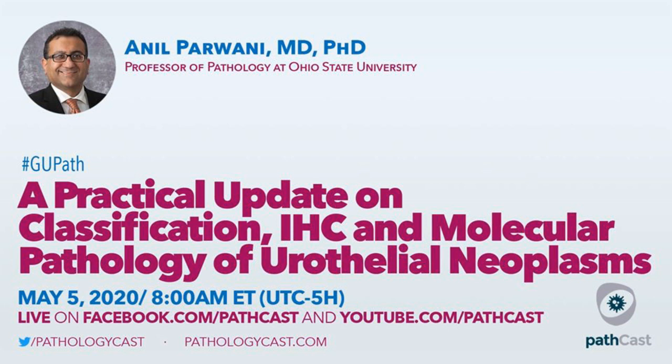So if a patient is coming to our hospital for treatment, has a urothelial carcinoma, has squamous differentiation, we will quantitate it now, and we will do the usual stains like CK20 and others.